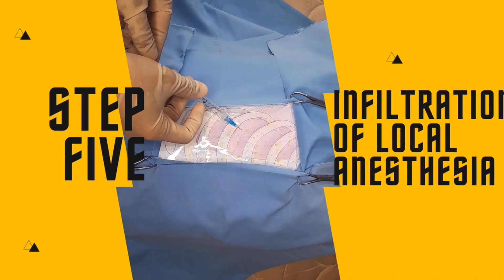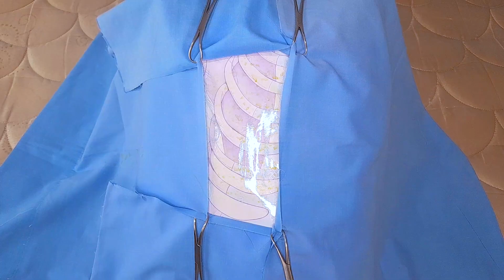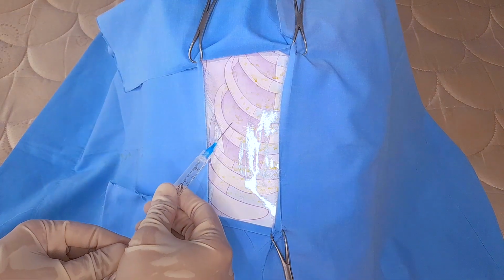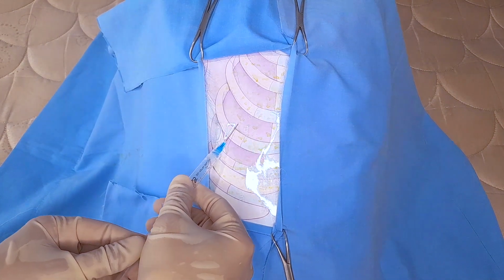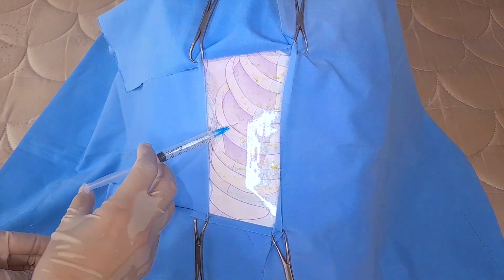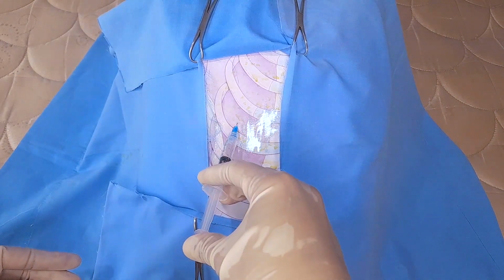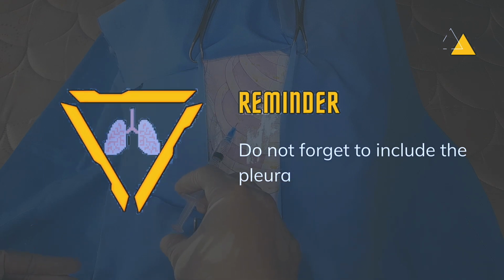Step 5. Infiltration of local anesthesia. Palpate for the 5th or 4th intercostal space at the anterior axillary line. Position the syringe bevel up into the subcutaneous layer of the skin. Infiltrate the anesthetic in all directions to block all intercostal nerve branches. Reminder: do not forget to include the pleura.